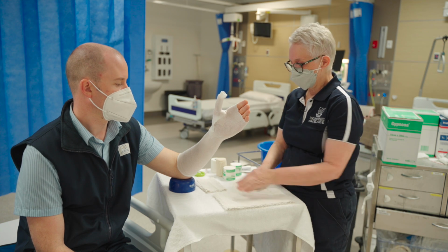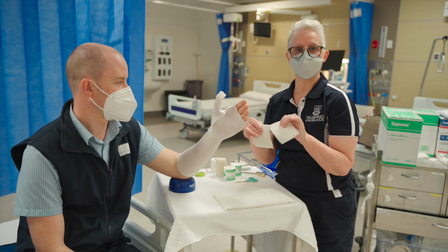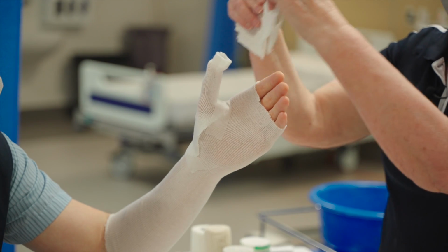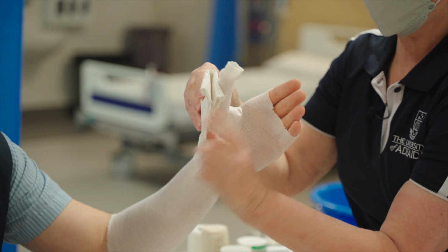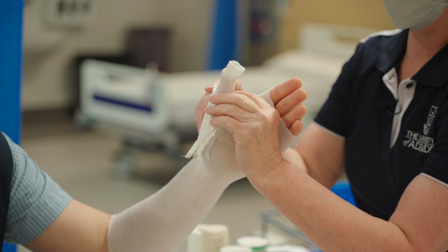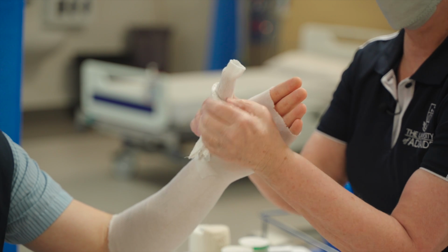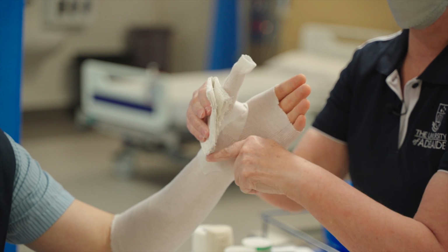So next we're ready to take our back slabs, and the piece we're going to apply is the little pant piece, the little shorts. So what we're doing once we've cut that is we're just going to measure the length, and what we want to do is make sure that once we've put it on, it starts at the mid of the knuckle, the joint here, and goes down to the base of the thumb. So that's about the length that we want.